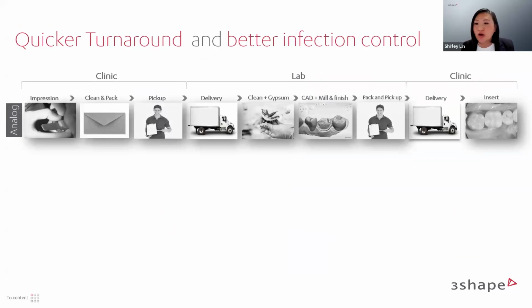So you've got trying trays, handling of impression guns and cartridges that aren't autoclavable. So with your analog impressions, as you can see, the workflow is you take your impression, you clean, pack it, do your lab sheet, you ask the courier to pick it up, and with the delivery of the courier, sometimes cases do get lost in transit as well. But once it gets to the lab, they then also have to clean it. They pour the models up, and then they scan it to do your CAD designs, and then mill and finish, and then pack, deliver, and then you go into insertion.